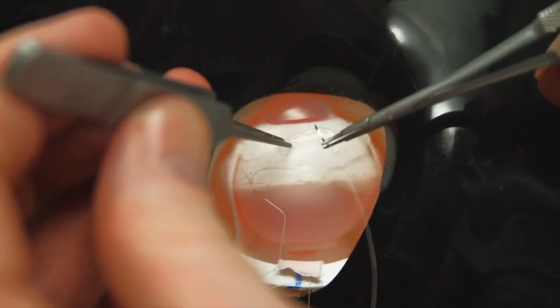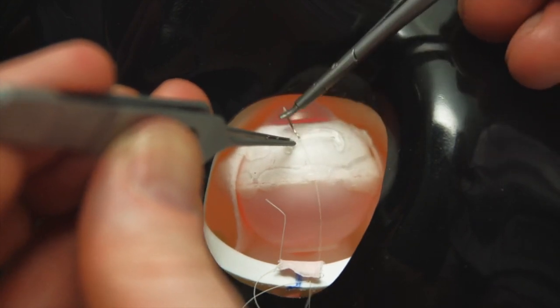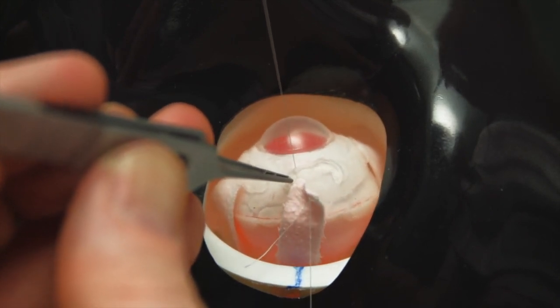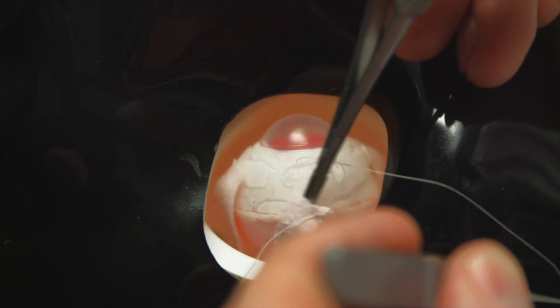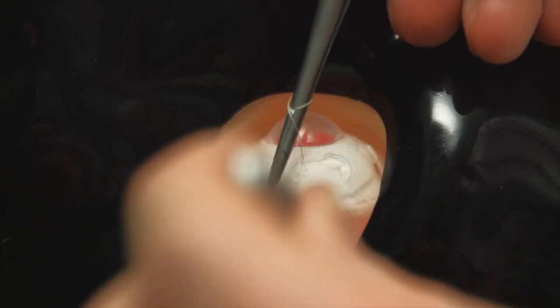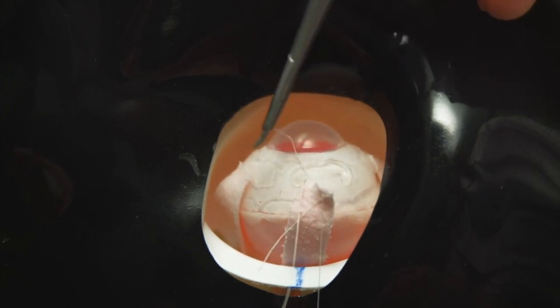Here we can see the lateral rectus being reattached to the globe having undergone a five millimetre resection. The inferior pole of the muscle is reattached to the inferior edge of the original insertion, and a nice deep scleral pass is made before pulling the muscle up to its correct position. The realism of this manoeuvre can be enhanced by placing a little bit of gentle traction on the lateral rectus to mimic the posterior movement of the muscle that one would find after a resection procedure.